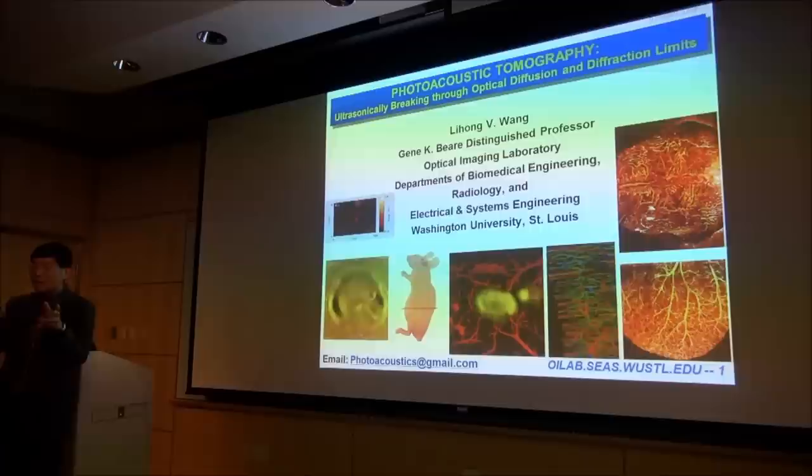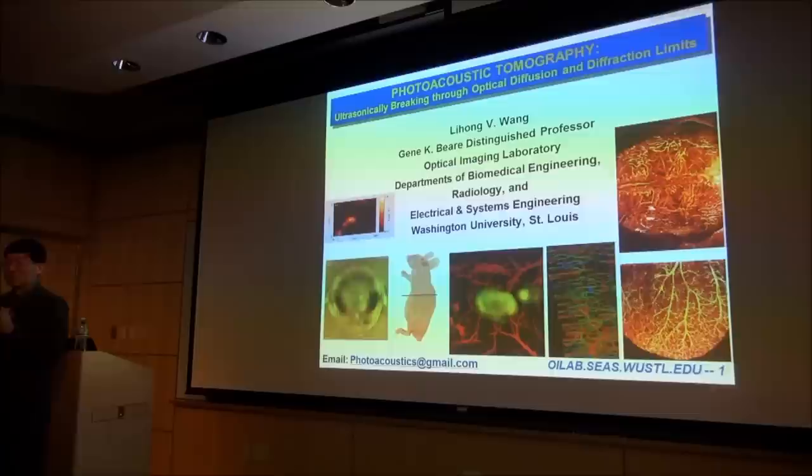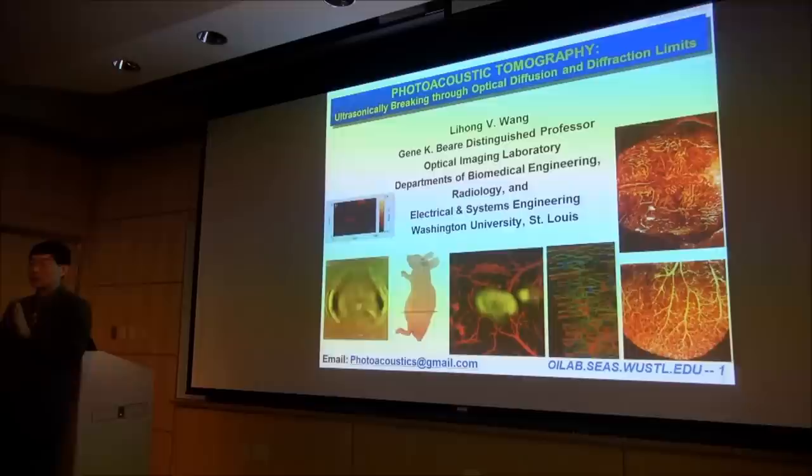And that allows us to scale. And that product also translates into about 200 pixels in the depth direction. So these are related. You can convert a frequency into axial resolution. Then it becomes a depth to resolution ratio as opposed to a product.